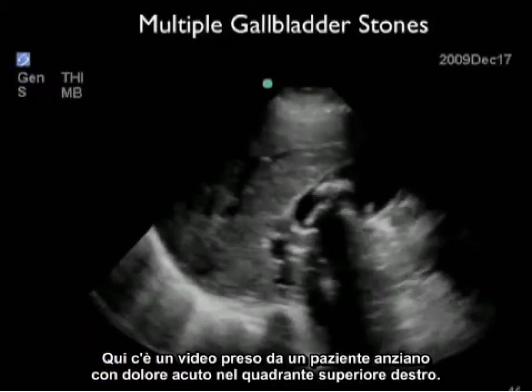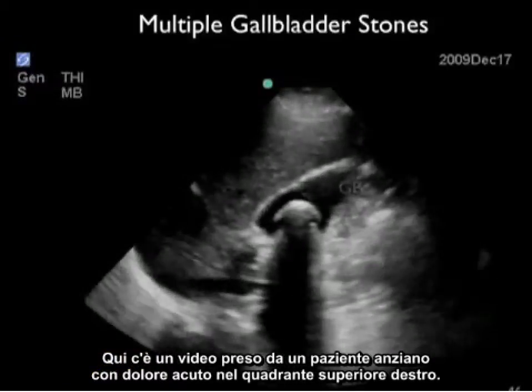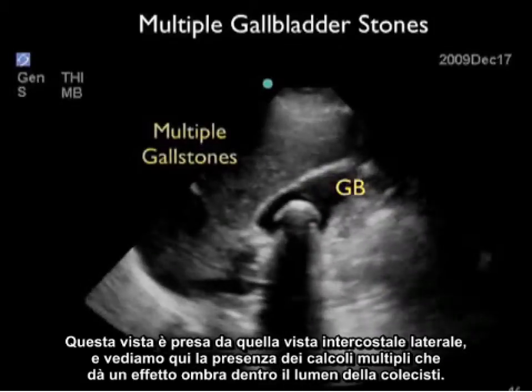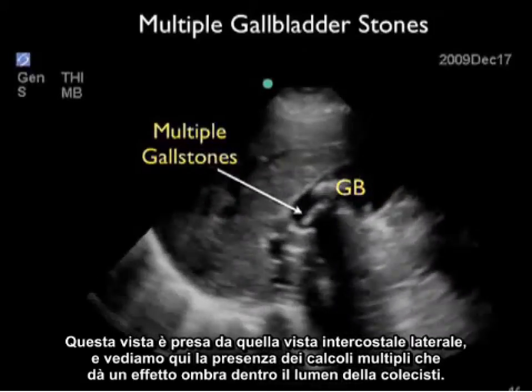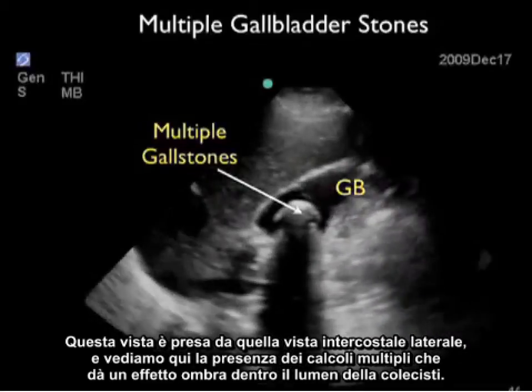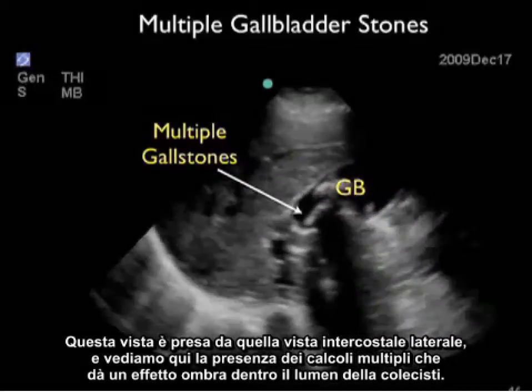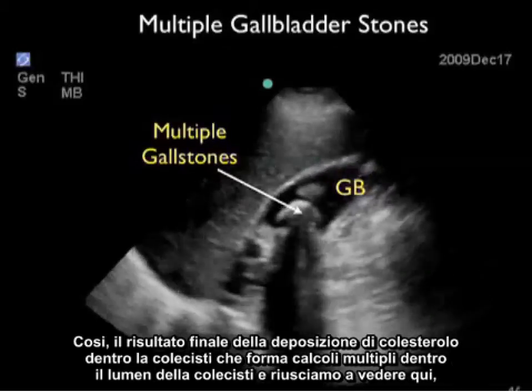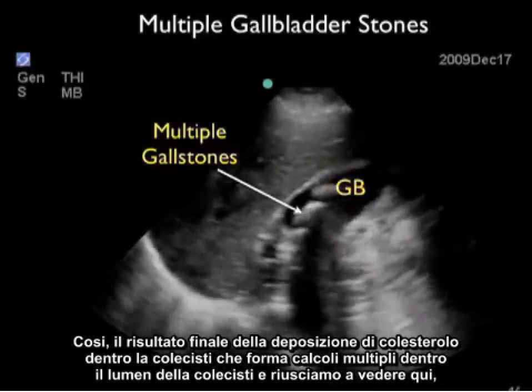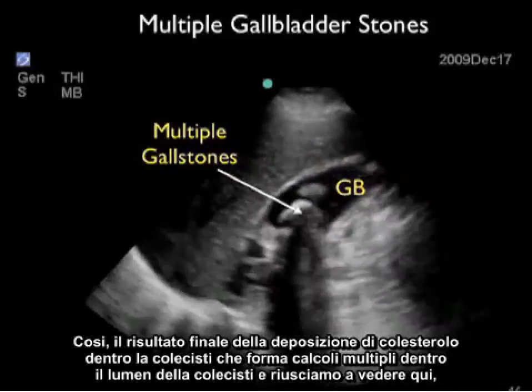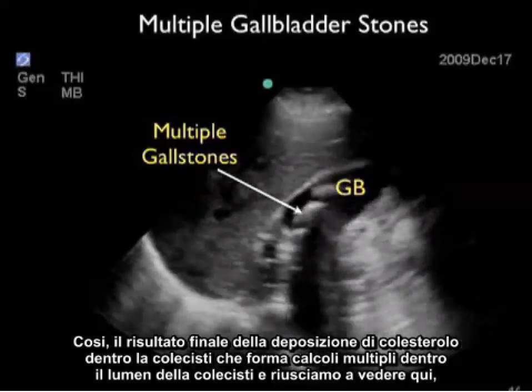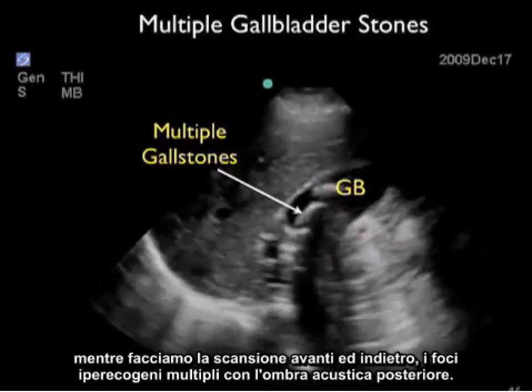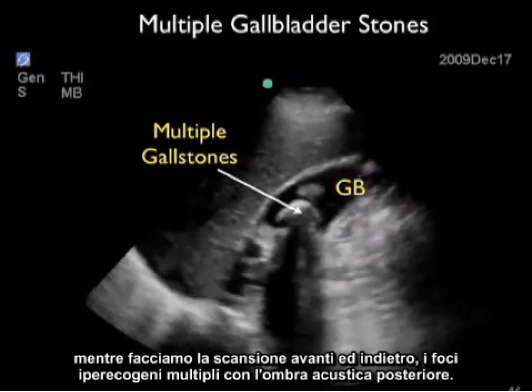Here's a video clip from an elderly patient with acute right upper quadrant pain. Scanning back and forth through the gallbladder from the lateral intercostal view, we see multiple shadowing gallstones within the lumen — the end result of cholesterol deposition forming multiple stones. We can see the multiple hyperechoic foci with posterior acoustic shadowing as we scan through.